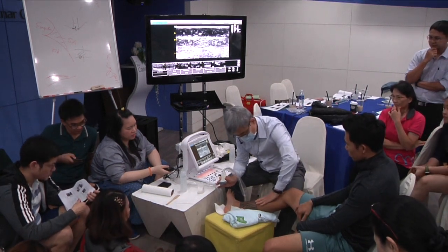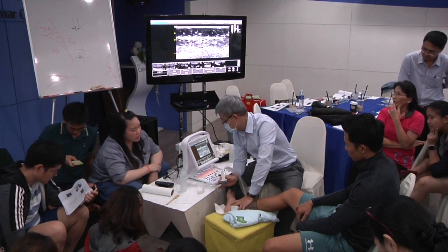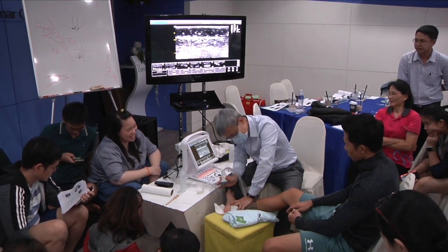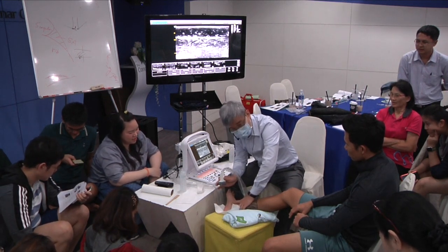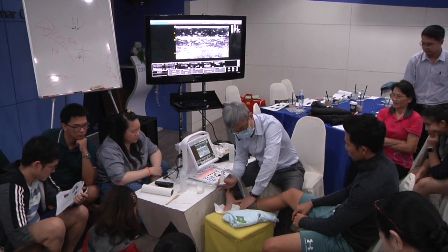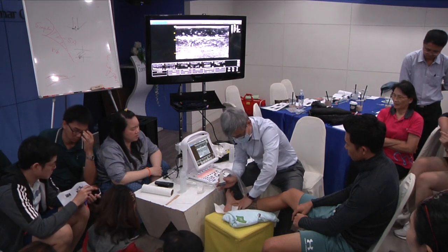From the tibia, the long axis of the tibia, and find the talus. I have some problem pronouncing that structure. You can use that with palpation. Okay, that's the middle bundle of the deltoid ligament. Easy, piece of cake. Medial malleolus, and find the talus. Good.